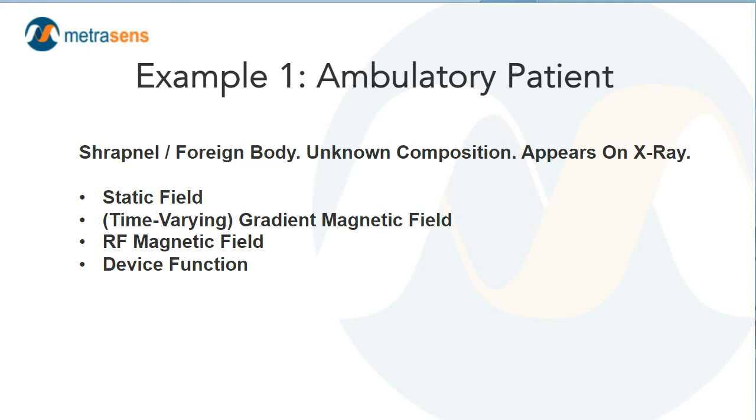You don't even need to bother to test it. So 3 millimeters being substantially smaller than the 25 millimeter conservative cutoff point by the US FDA tells me that the heating potential for the RF magnetic field really is non-existent as well, which leaves only device function, but there is no function to the BB. It doesn't do anything inside the patient, so we can cross that one out.